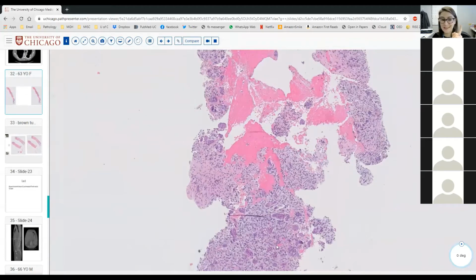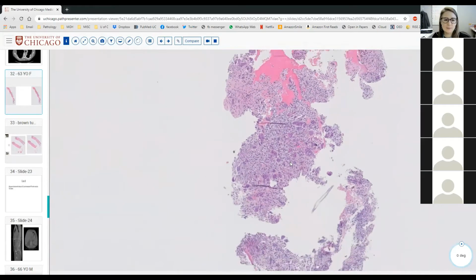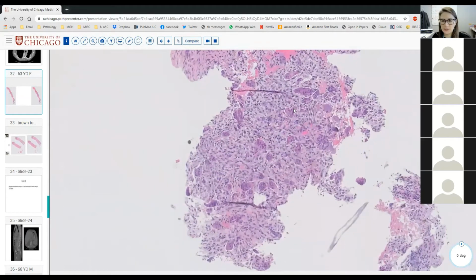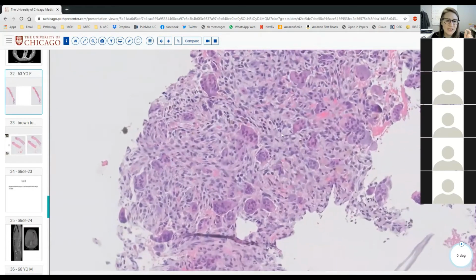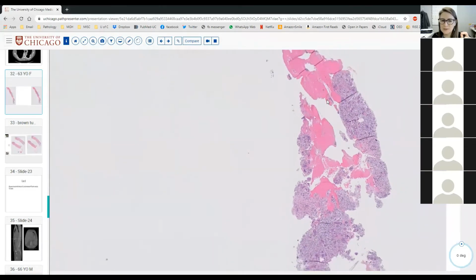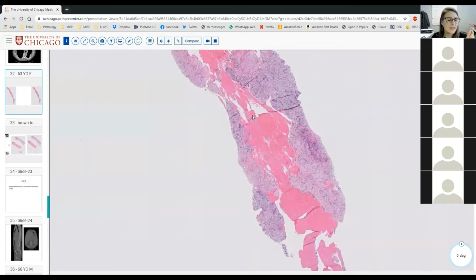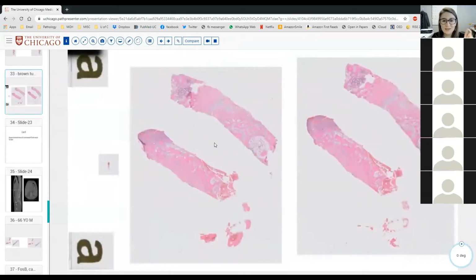So the thing that we don't always think about, because we don't often see it biopsied, but looks exactly like what you might see in an aneurysmal bone cyst, is brown tumor of hyperparathyroidism. Yeah. So in this case, we would expect USP6 gene rearrangement to be negative. As I said, I don't think it was performed on this case, but in the setting of hyperparathyroidism and bone disease of hyperparathyroidism, you can get these aneurysmal bone cyst-like lesions, so-called brown tumors, okay?